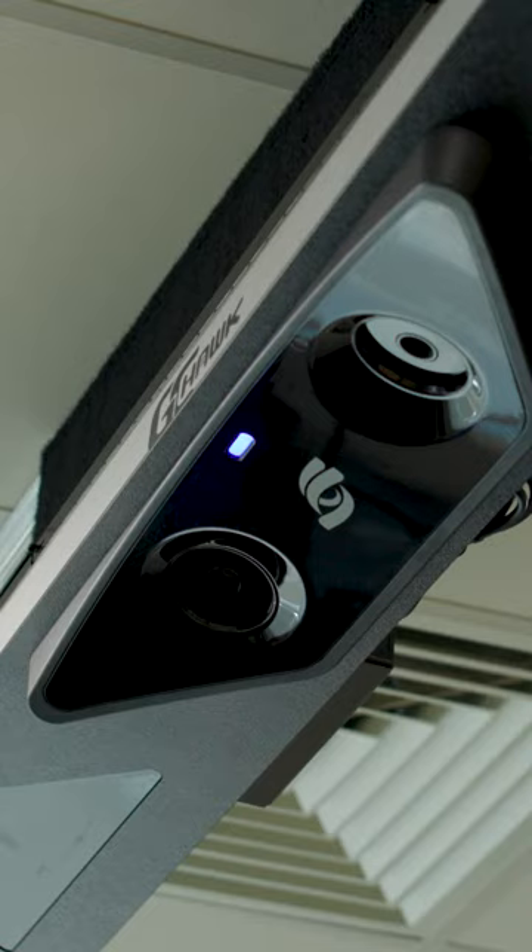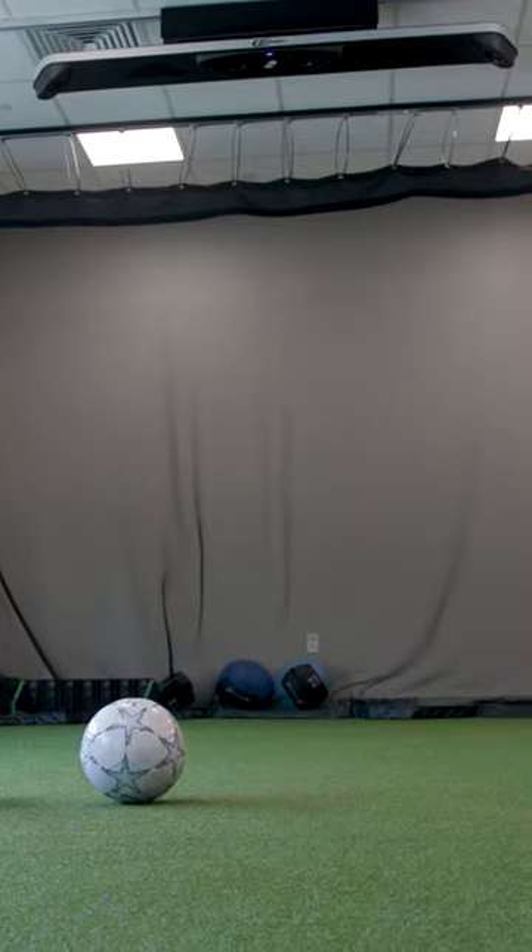It's a pretty incredible tool that we can have here. The simulator kind of helps me read where my percentage is. You don't want to re-injure yourself — it's especially important for that return to sport plan.